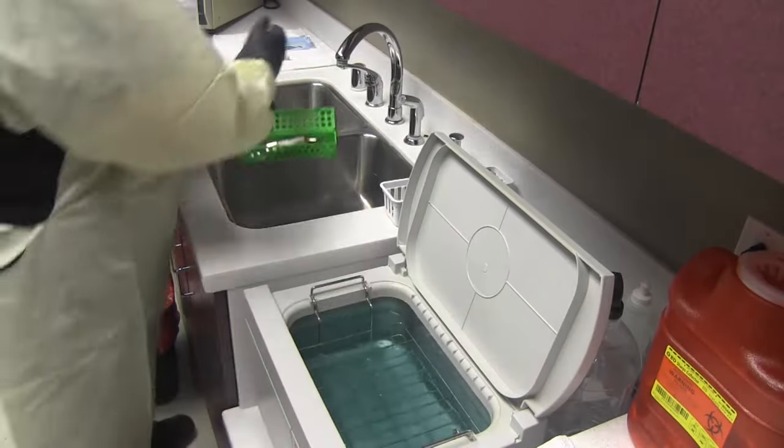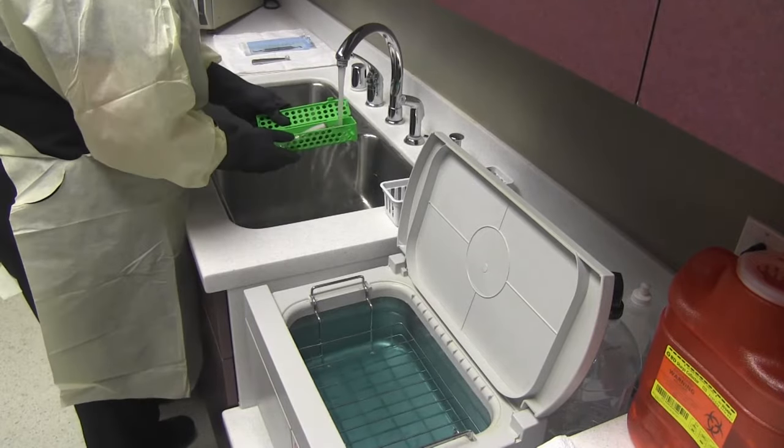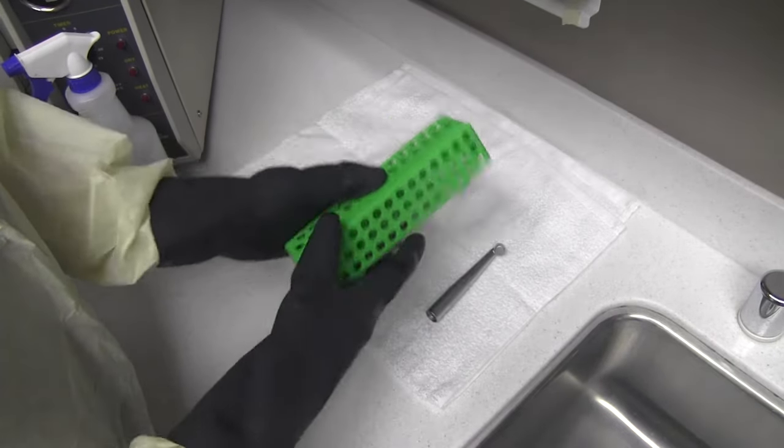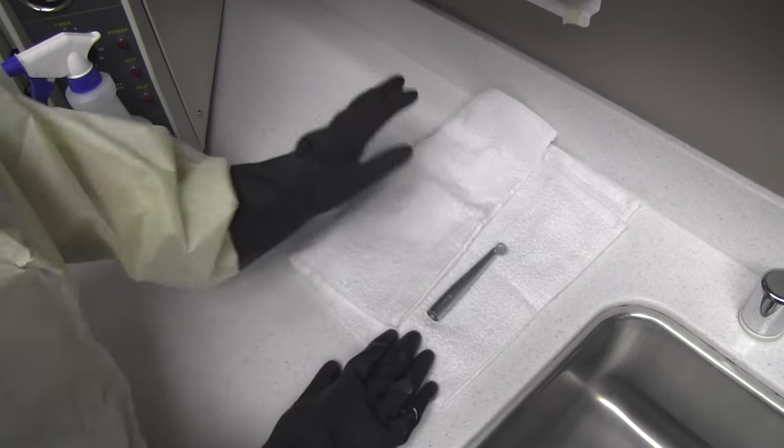After the ultrasonic cleaner has finished its cycle, remove the cleaned instruments and rinse them under tap water. Place the wet instruments on a towel and gently pat to remove excess water.